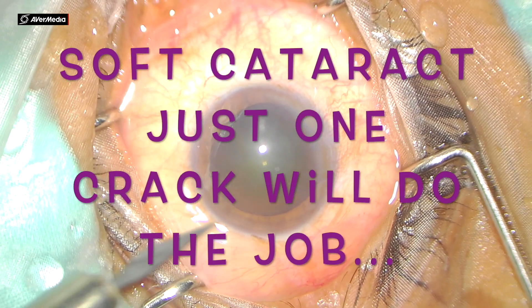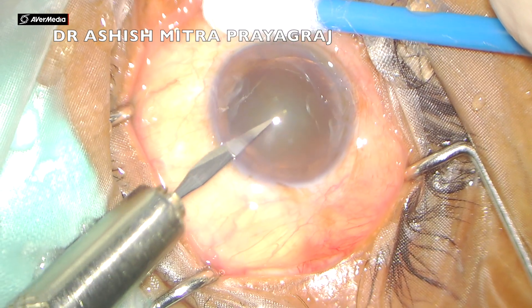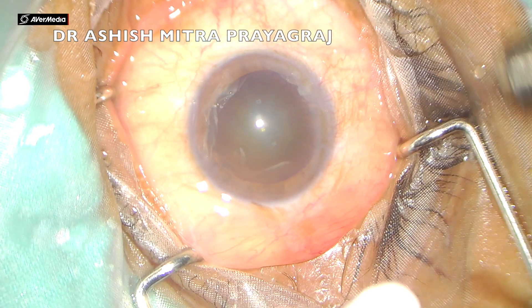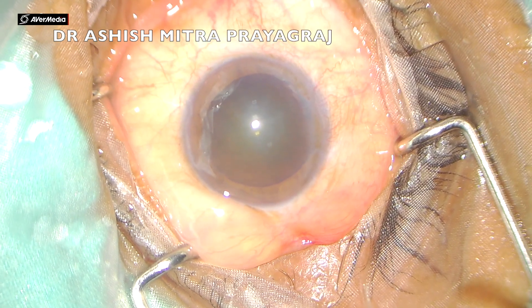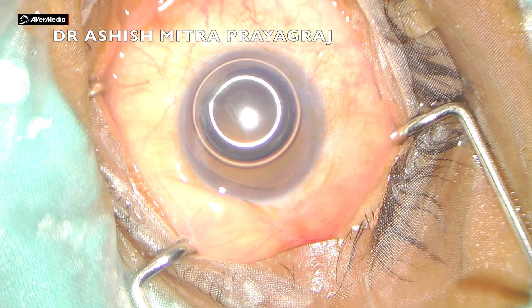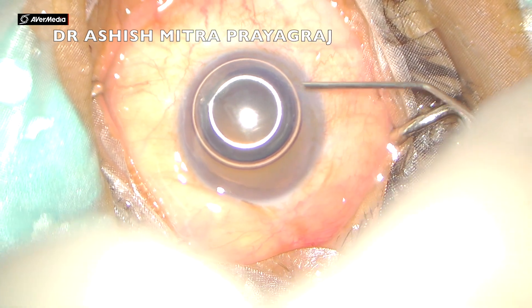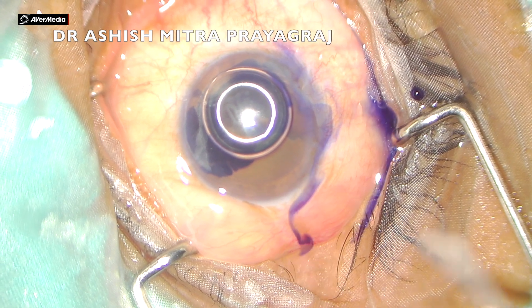Soft cataract — just one crack will do the job. This is one more video for beginners to learn how to manage a soft cataract, because when you get a soft cataract the surgeon himself is anxious at times, because what happens is we end up in a crater as it is difficult to hold such a nucleus.